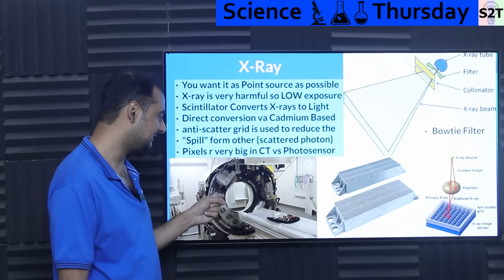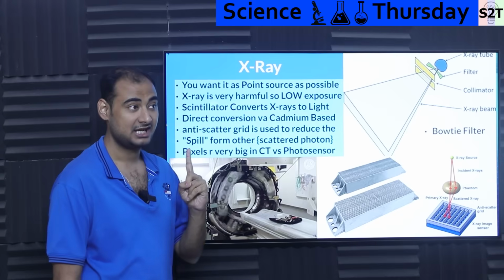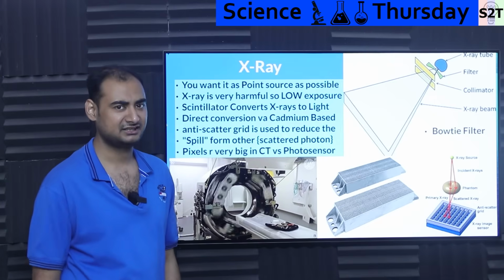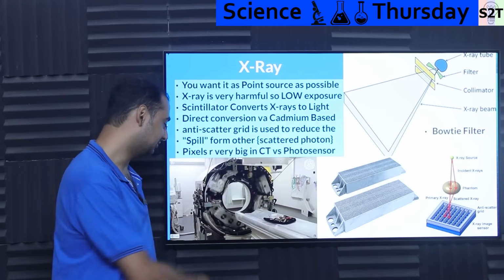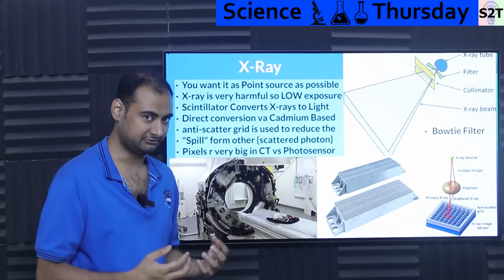Now, the biggest question people will have when they see this is, how the heck is it carrying that sort of X-ray tube? Because an X-ray tube requires bonkersly high voltage. We are talking about 40 kilovolts kind of high voltage. Not all of them are that high, but they can go. And some might say, oh, I have dealt with a 100 kV one. They do require oomph. And not to mention, detection also needs to dump a lot of data, very quickly.